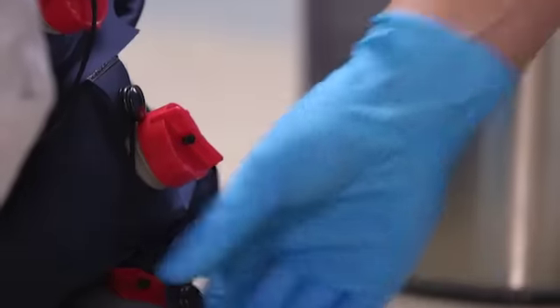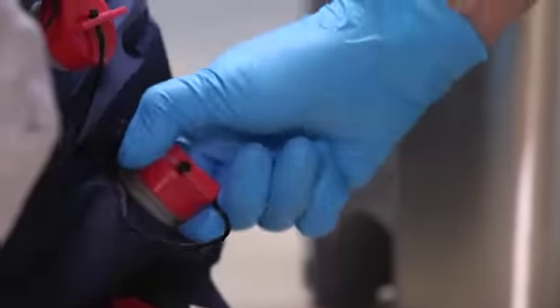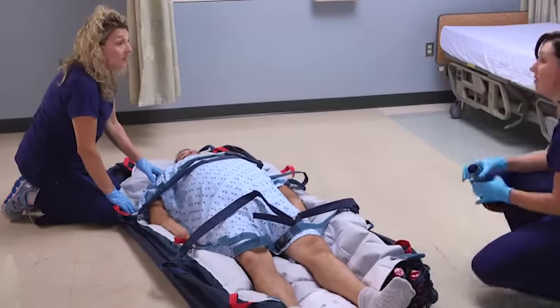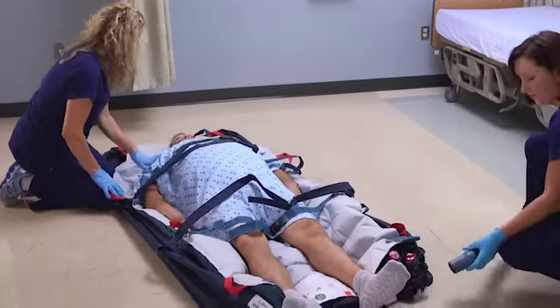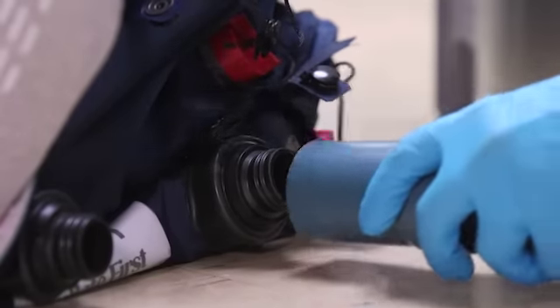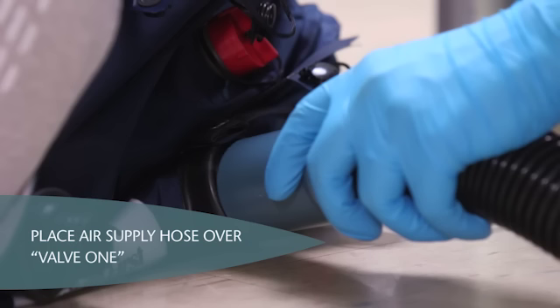Check that the red-capped valves are fully closed. The inflation valves should not be capped. Check that the black Teflon-coated bottom side of the HoverJack is against the floor. Explain the inflation process to the patient. Begin inflating the HoverJack by placing the air supply hose over the inflation valve located on the air chamber against the floor, labeled Valve 1.